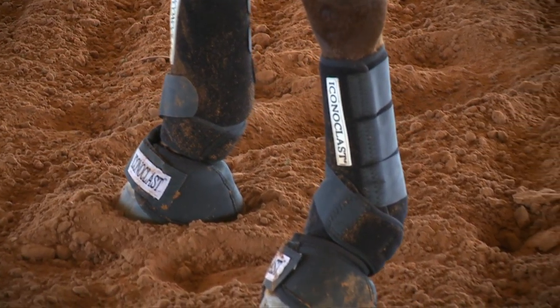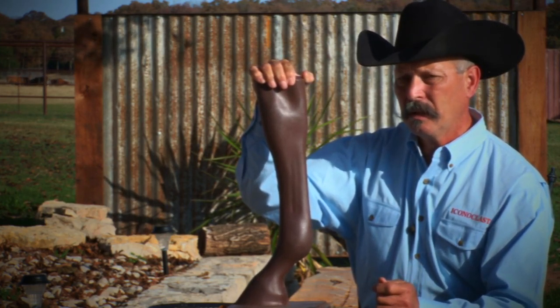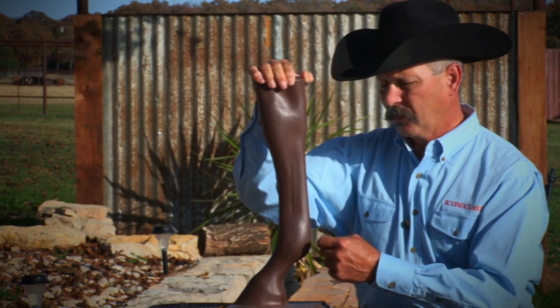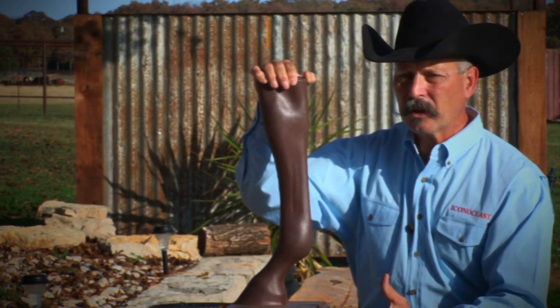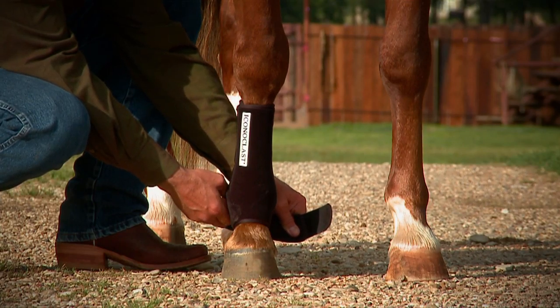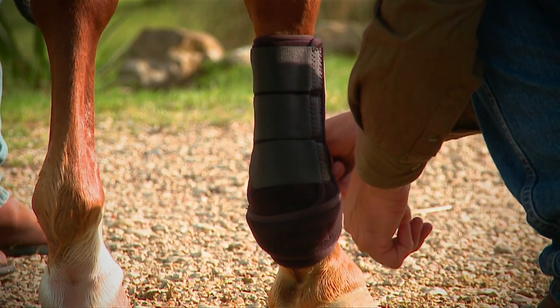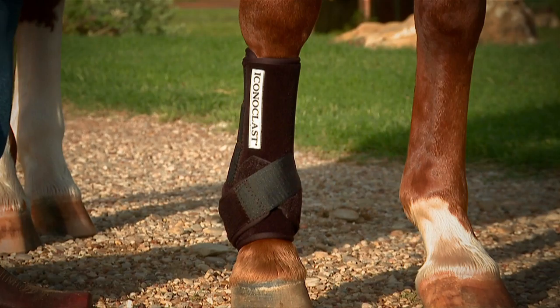What we did with the Iconoclast boot was rethink that whole issue — how can we get to a place where we can support that soft tissue and avoid hyperextension or those extensive injuries that have been plaguing the horse industry for so long. The way to do that was to extend the material down there. We're taking an elastic material that we're wrapping around the fetlock or the sesamoidal region, and by virtue of the double sling straps, we bring one strap around one side of the fetlock at the base and attach it at 45 degrees, lifting and cradling the soft tissue. We then take the second strap at the base of the boot, bring it the opposite direction around the base of the fetlock, and attach it at 45 degrees. What that does is lift and cradle the sesamoidal region of the horse.